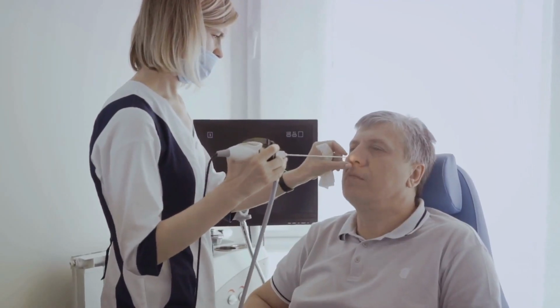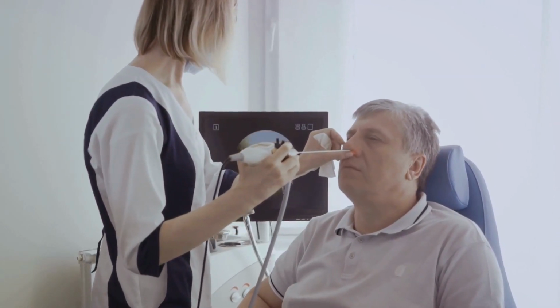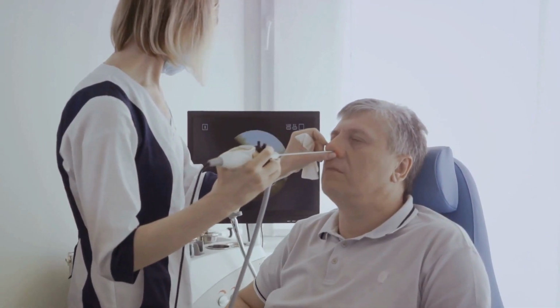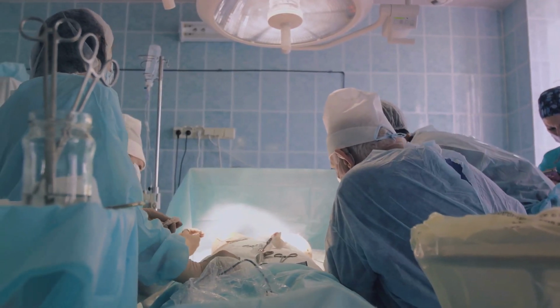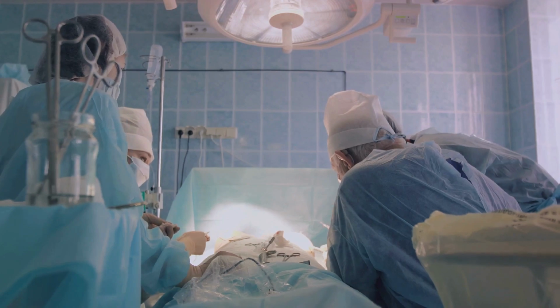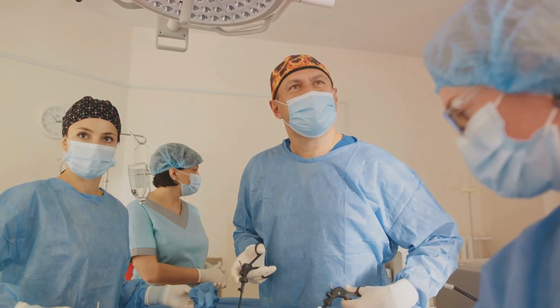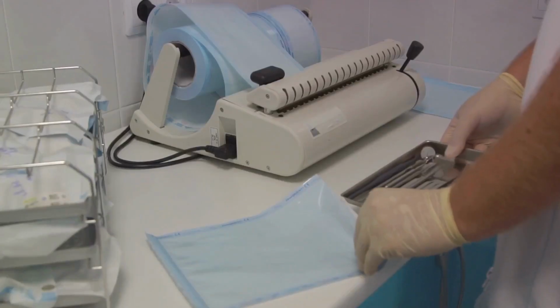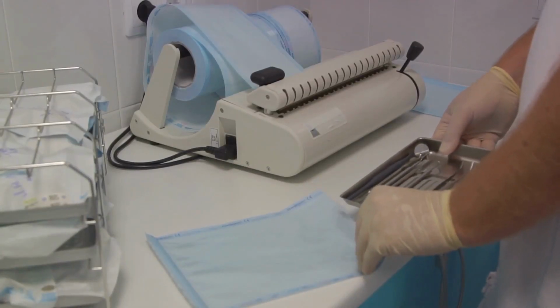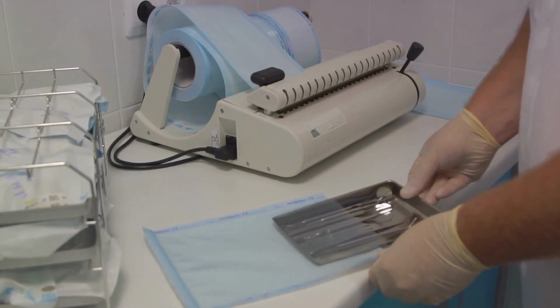This method provides a visual guide through the nasal passages and trachea, allowing for a more controlled and precise tube placement. Now let's talk about equipment. No matter what method you choose, the importance of equipment sterilization cannot be overstated. Sterilization helps to minimize the risk of infection, a potential complication that can lead to serious consequences. So always ensure that your laryngoscope, endotracheal tube, and other equipment are properly cleaned and sterilized before use.